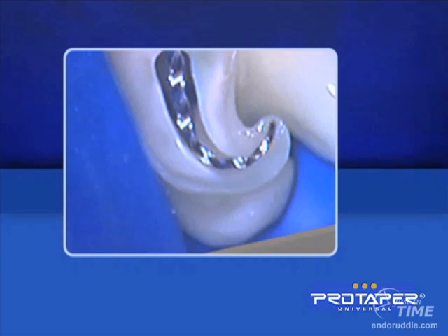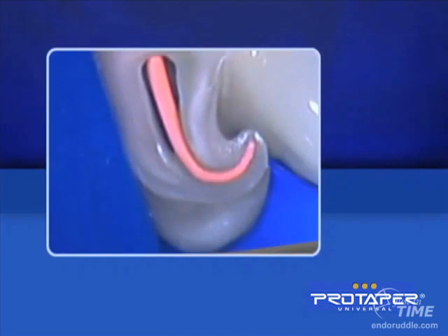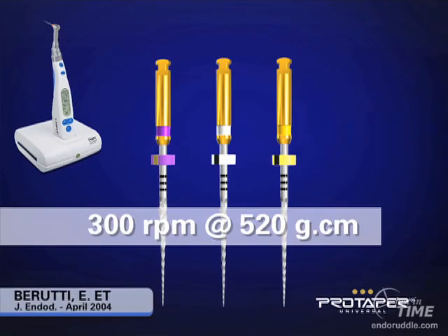And of course, if we have a smooth shape, it's quite easy to slide a matching ProTaper F2 gutta percha cone around the curvature and to length. So we have a set of ProTaper files, and although you have several instruments to choose from among, most posterior teeth can be shaped with 3 or 4 instruments.